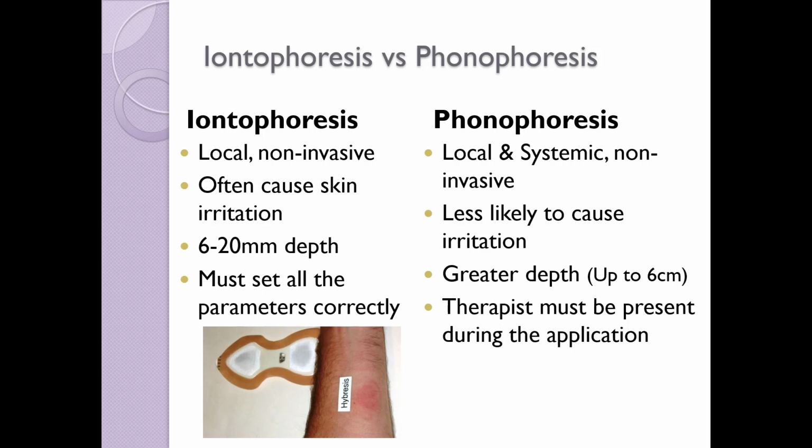The primary benefit to using phonophoresis include local and systemic, and it is non-invasive. The medication does not need to go through the systemic system, including the stomach, intestines, and bloodstream, to target tissues. However, since phonophoresis is less targeted than iontophoresis, it may also have an effect on the systemic functions as a side effect.